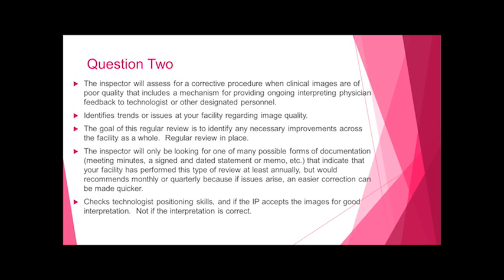All right, question number 2. The inspector will assess for a corrective procedure when the clinical images are of poor quality, that includes a mechanism for providing ongoing interpreting physician feedback to the technologist or other designated personnel like management, supervisors, and so on. So this identifies trends or issues at your facility regarding image quality. Now, the goal of this regular review is to identify any necessary improvements across the facility as a whole.